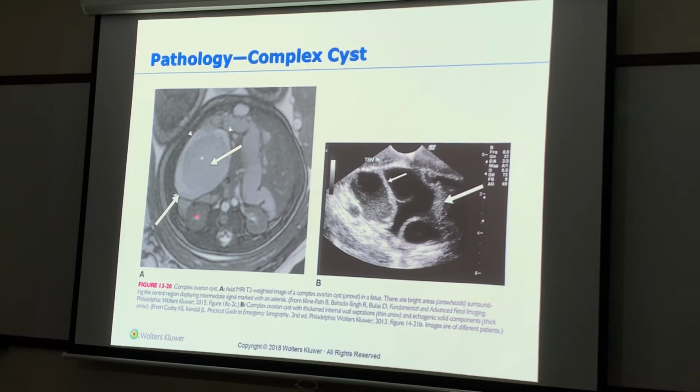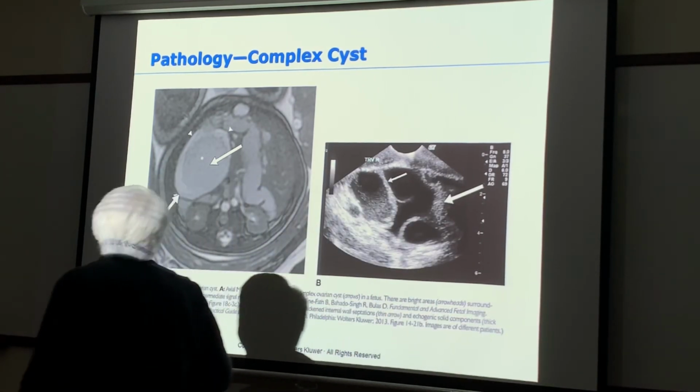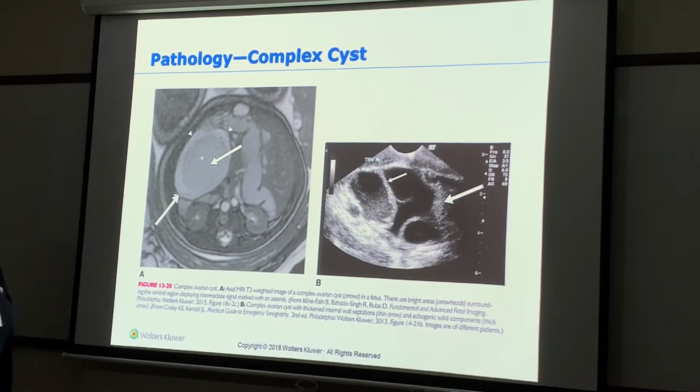What are these right here? Kidneys. So what's going on up here? What do you think it is? Look, it's at the level of the kidneys.